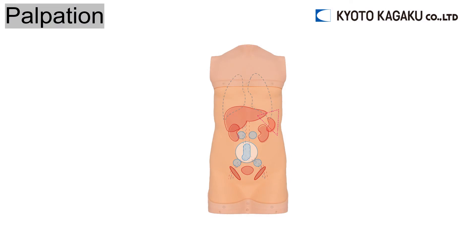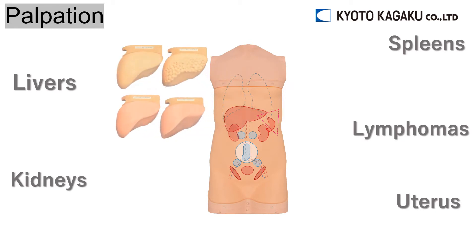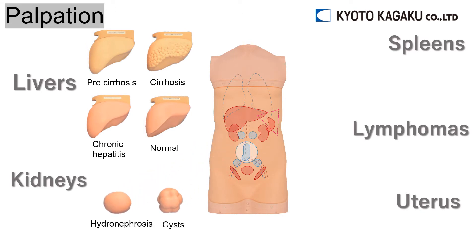A wide variety of organs can be placed freely inside the simulator to practice palpation. Four livers: pre-cirrhosis, cirrhosis, chronic hepatitis, and normal. Hydronephrosis, cysts, and two spleens: slightly enlarged and enlarged.